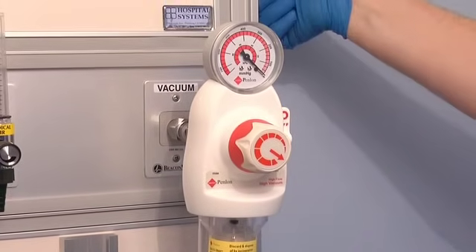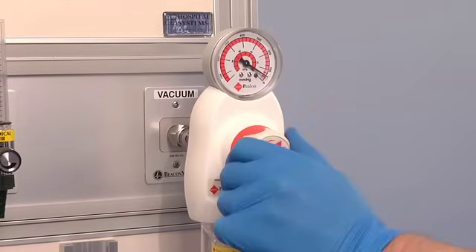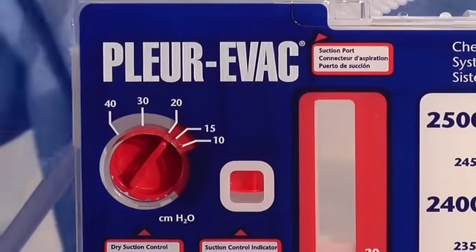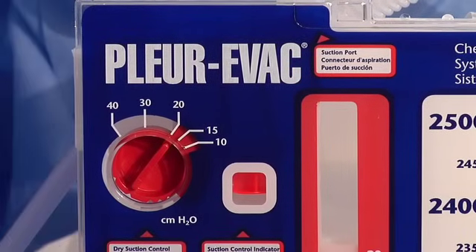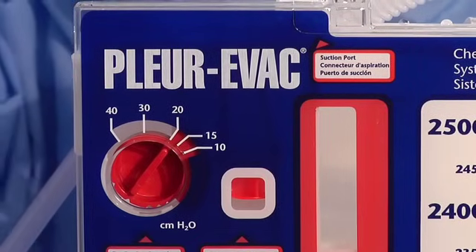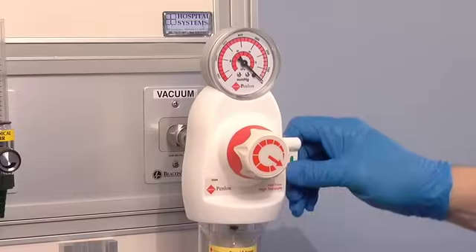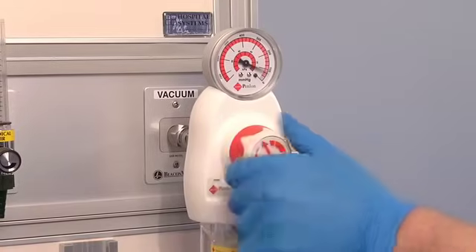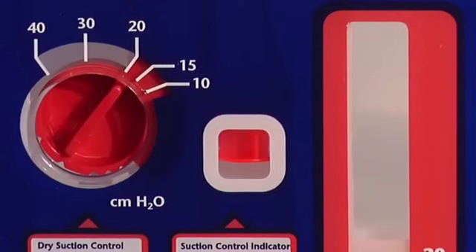No fluid is required in the suction column. Increase source suction until the orange float appears in the indicator window. It is important to turn the regulator up until the orange float appears. If you do not see the float, continue to increase source suction until the float is in the window.